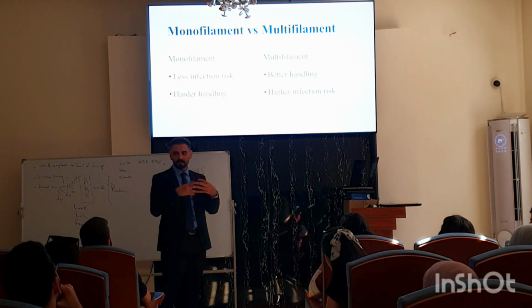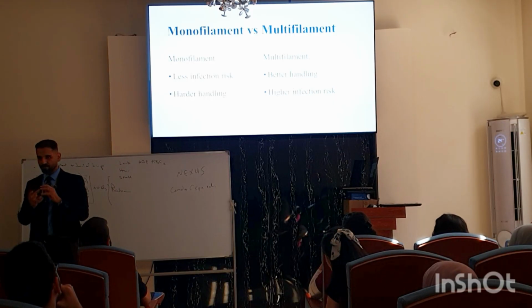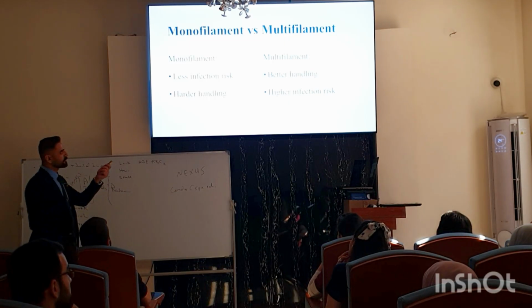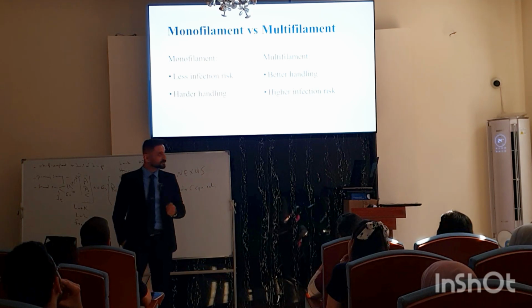It has no multiple spaces inside. It's just one structure, so there's no place for the bacteria to grow inside these foreign bodies, okay? Because the suture is a foreign body, you know. Regarding the polyfilament, it has better handling, but with a higher risk of infection.